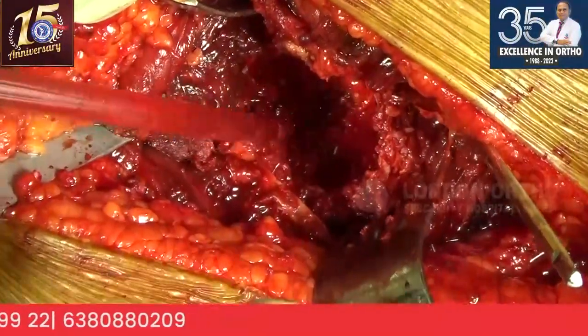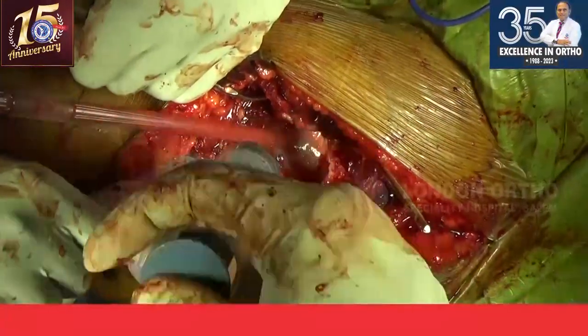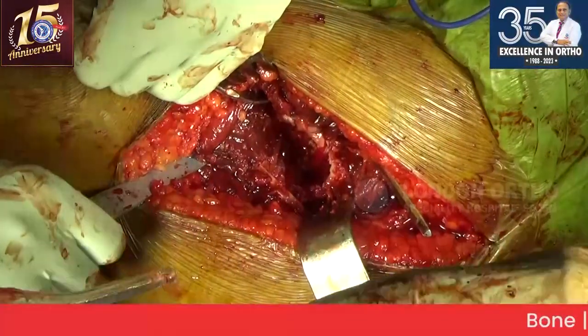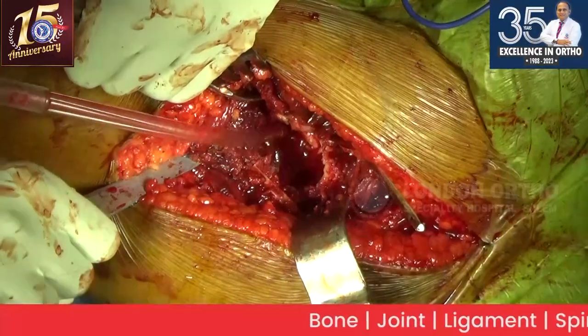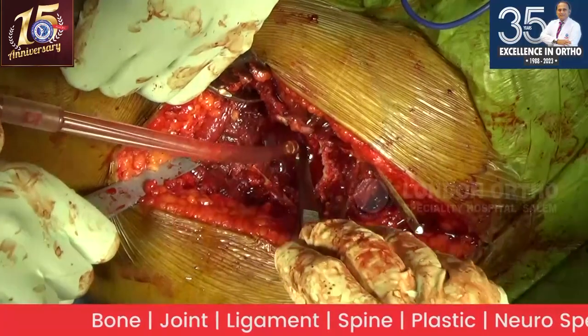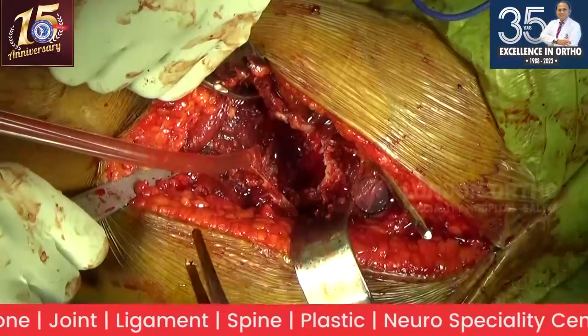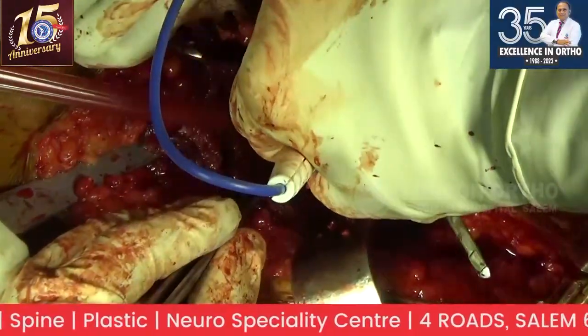Yeah, I am going to the medial floor. When I saw that hole, I was a bit concerned. There's a chance for me to break into that. So I'm trying to maintain my reamer more posteriorly. And I don't want to suddenly dip in, sometimes it happens. So I'm slowly approaching the medial floor.